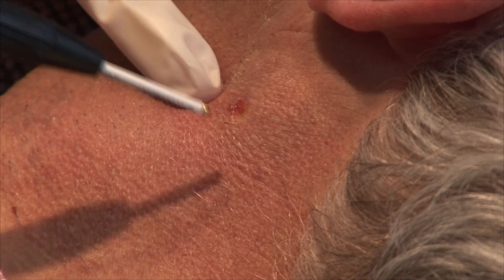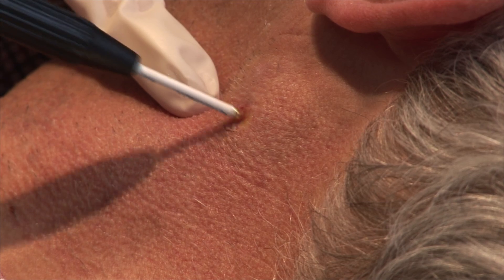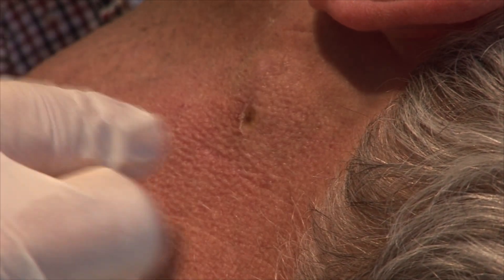The wound is covered with a simple adhesive bandage upon completion of the procedure. Inspect the site at six months to ensure that no tumor has recurred.